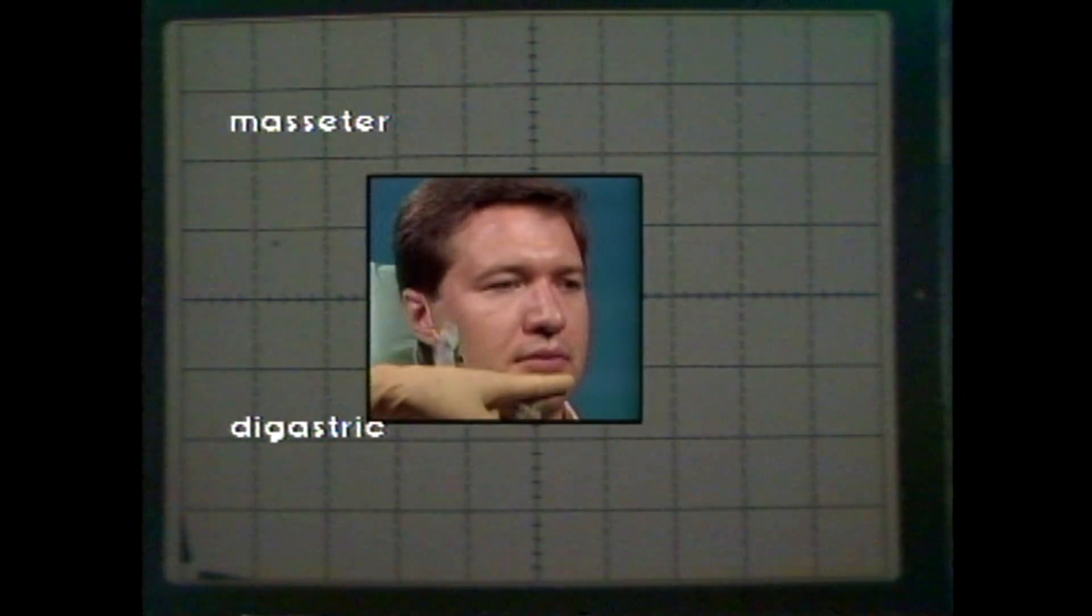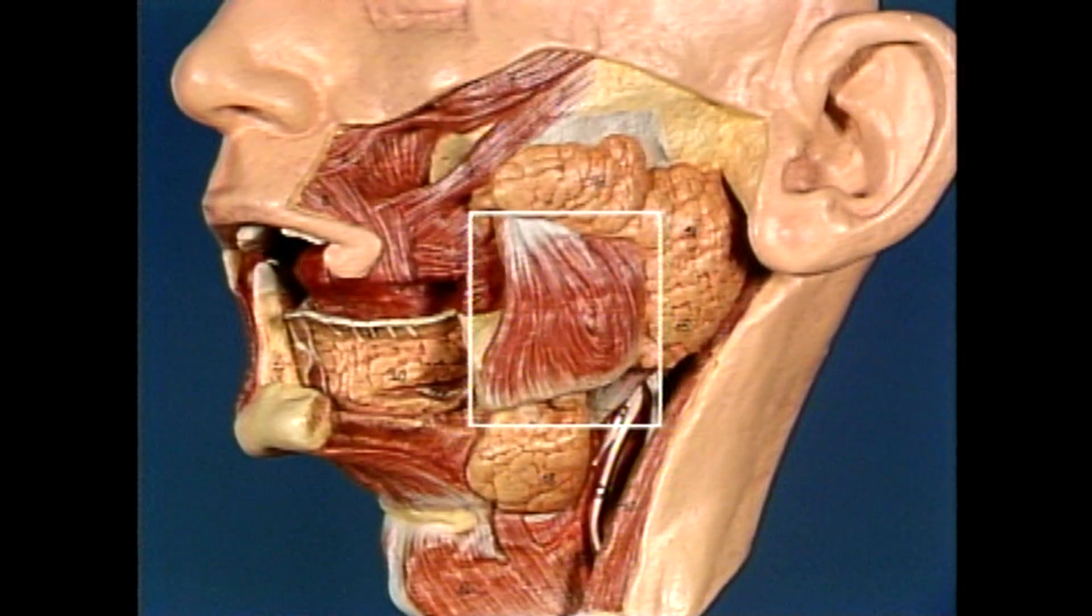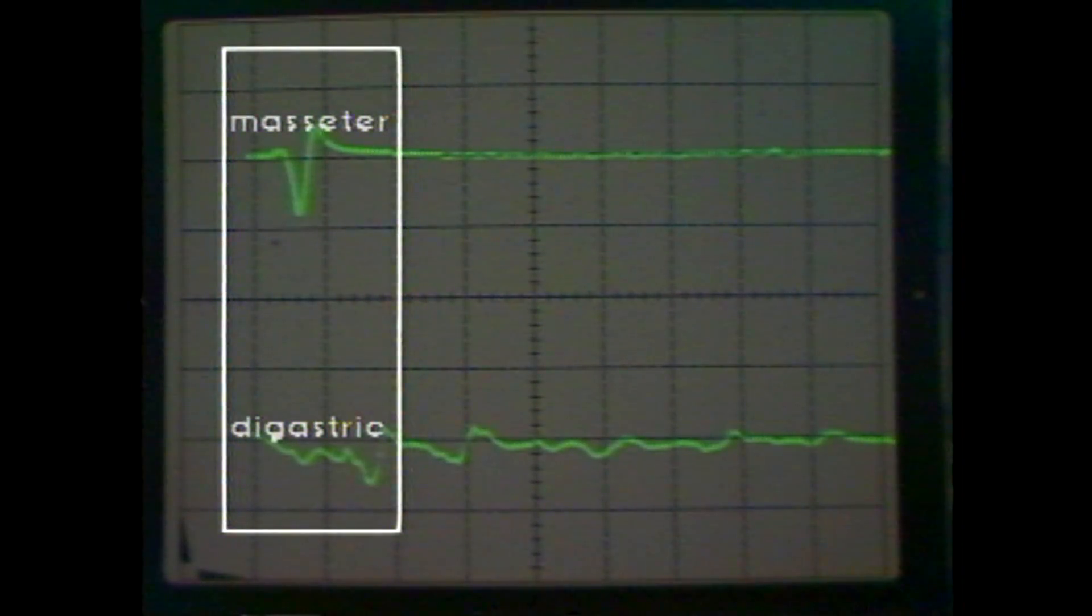The subject is instructed to swallow and relax until the mandible is in the clinical rest position. A reflex hammer is used to indirectly strike the chin, trigger the sweep beam on the oscilloscope, and drive the mandible slightly downward. Muscle spindles in the masseter muscles are lengthened and stretched. Neurons of these sensory receptors will synapse with and recruit motor neurons in the motor nucleus of the trigeminal nerve. A synchronous recruitment of several motor units is demonstrated by the amplitude of the biphasic wave seen after the stimulus.